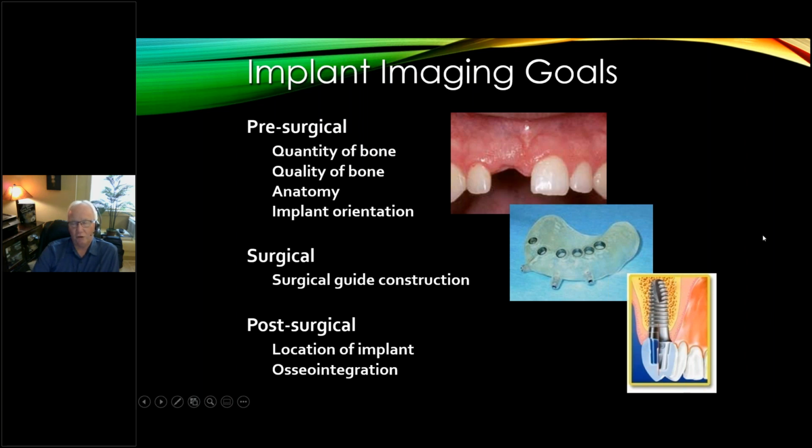I think everybody should place implants. I know I admonished a few of you at the beginning and said a lot of you can't do it or won't. But with a surgical guide, every dentist should be able to do the onesies and twosies. You think you can eyeball this and split the difference and place an implant in there? I don't think so. Especially if you're starting out, you should use the technology that's available and you will not get into trouble.